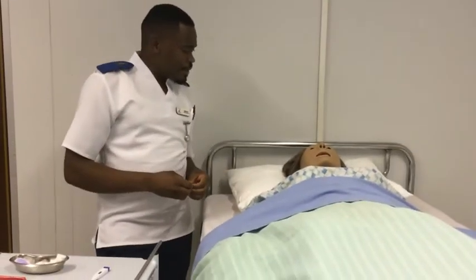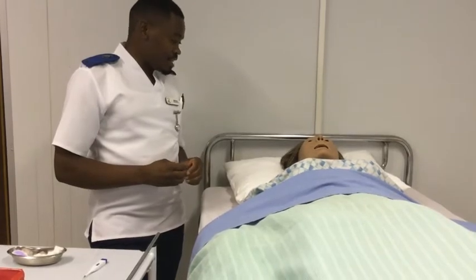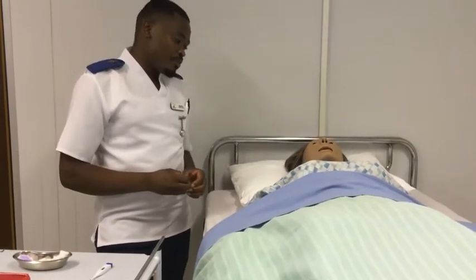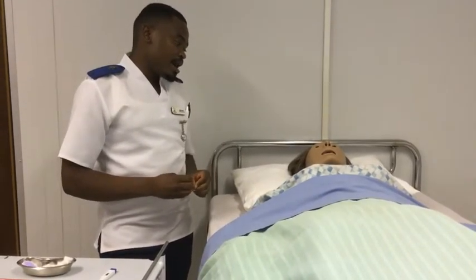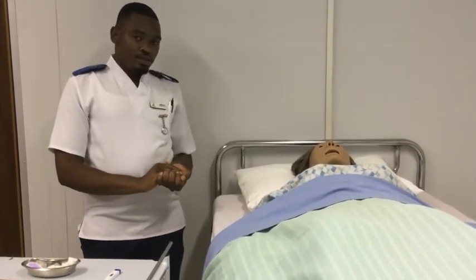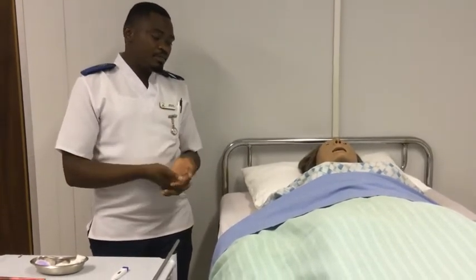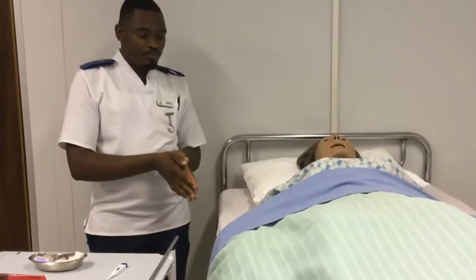Good morning Mrs. Susie. My name is Rafael. I am your nurse today and I am going to perform TPR — I am going to assess your temperature, pulse and respiration. Now, if you allow me, I would like to go and wash my hands and then start the procedure. I hope you are still comfortable. Thank you.